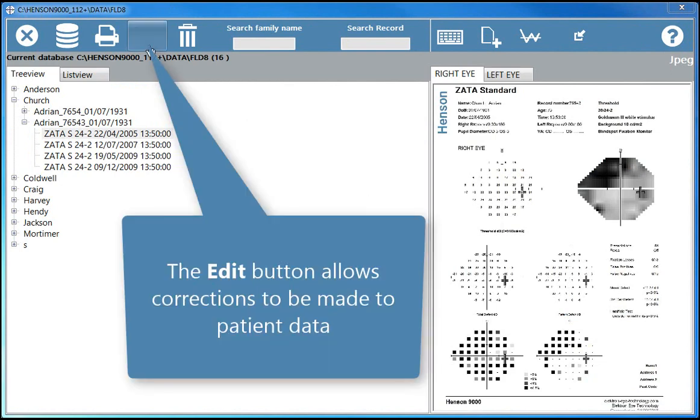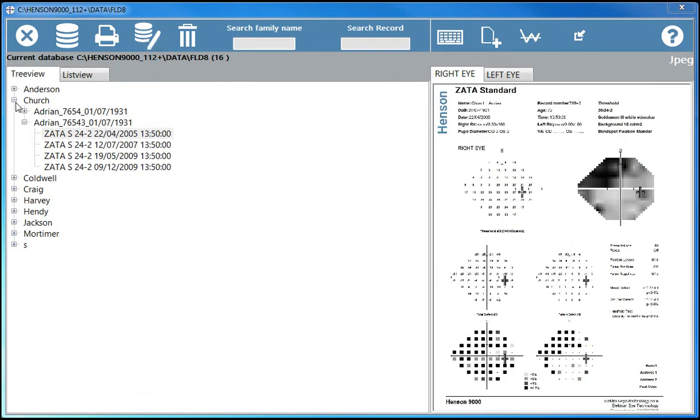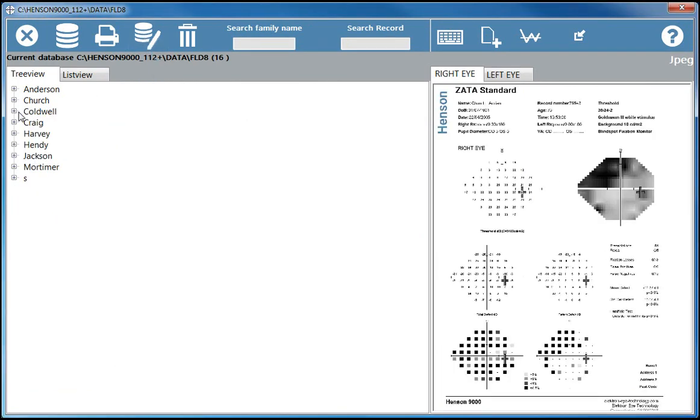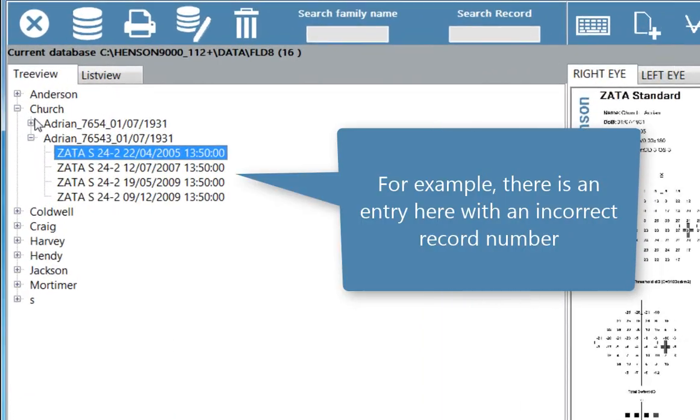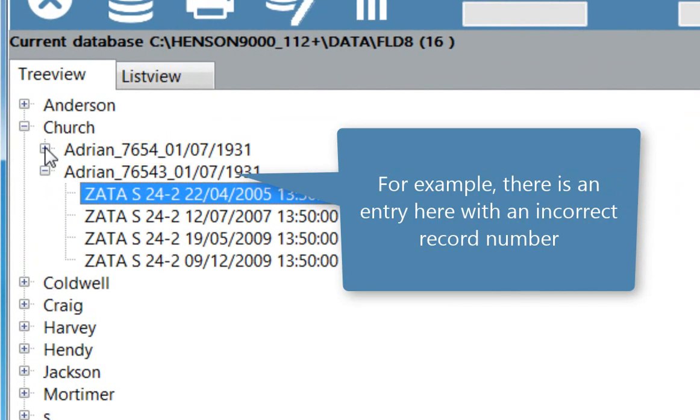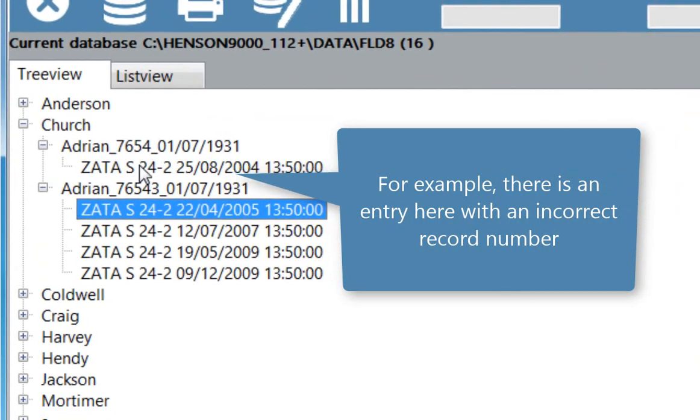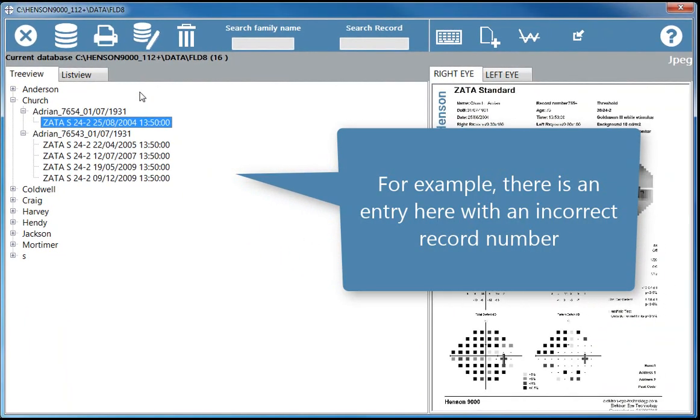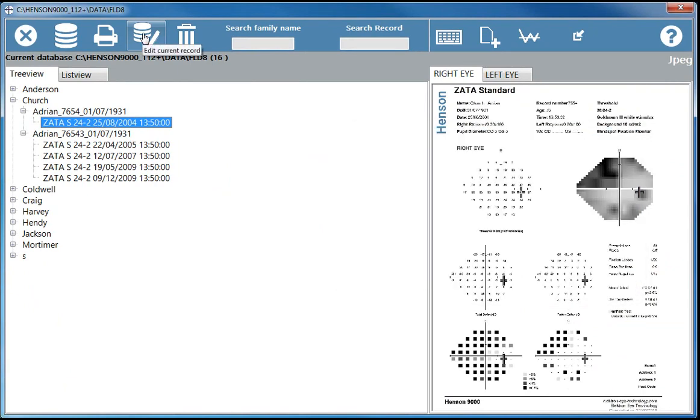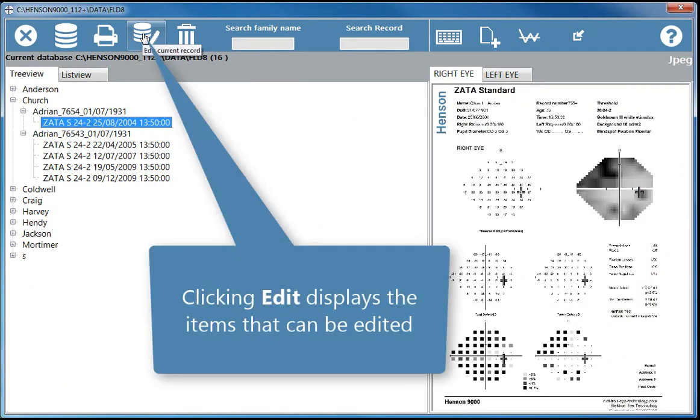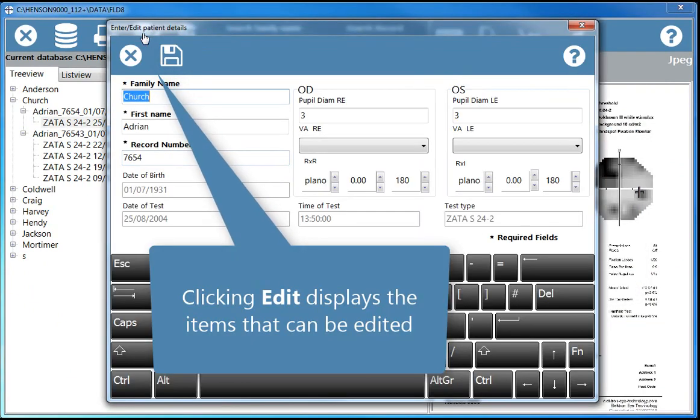The edit button allows corrections to be made to patient data. For example, there is an entry here with an incorrect record number. Clicking edit displays the items that can be edited.